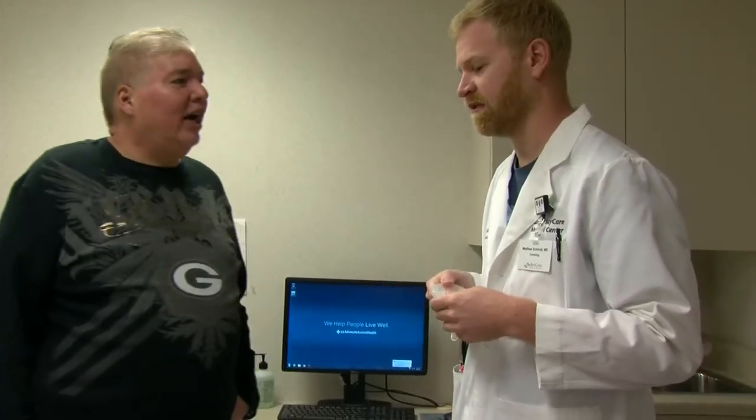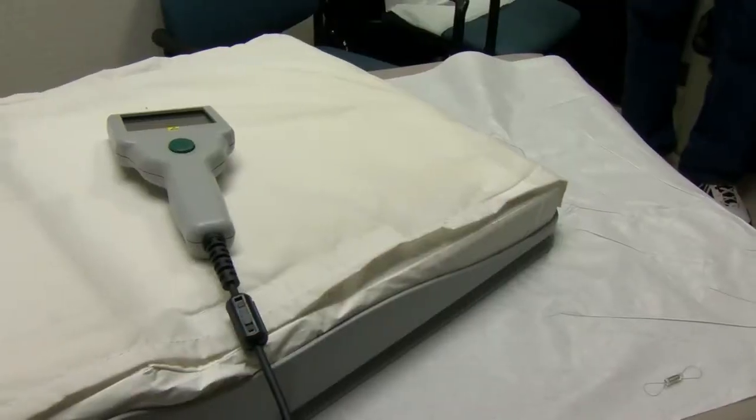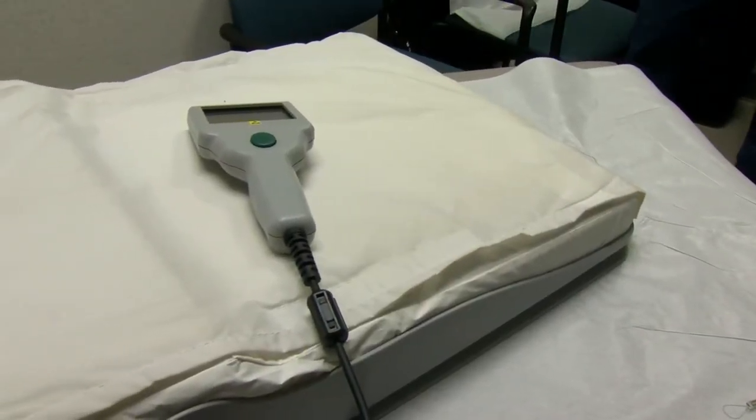First, a heart failure monitor is implanted into the pulmonary artery to measure his blood pressure around the clock. Dr. Schmidt performed Jauhn's procedure last October. And essentially what it is, it's a pressure monitor, and it sits in one of the lung arteries. We put it in through the groin, through the vein.